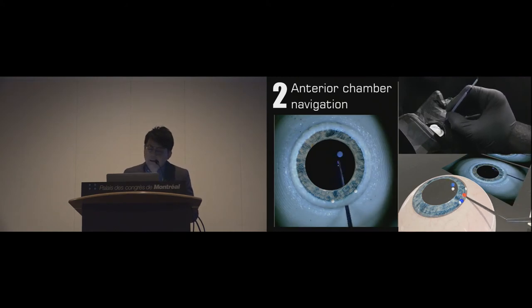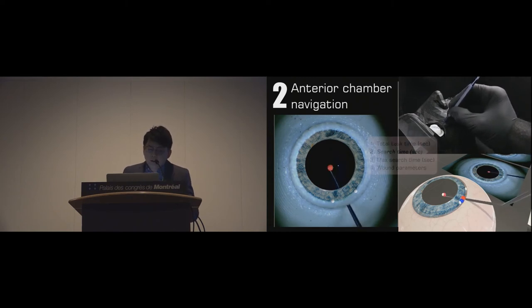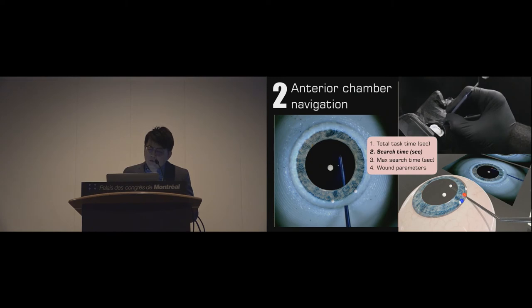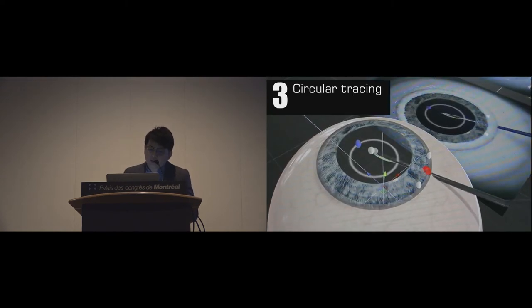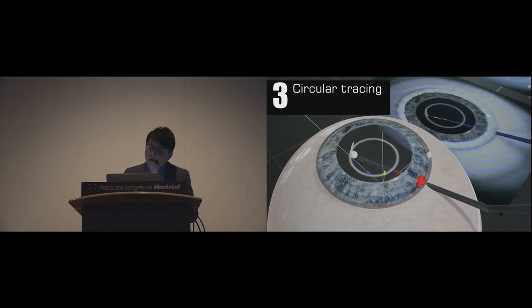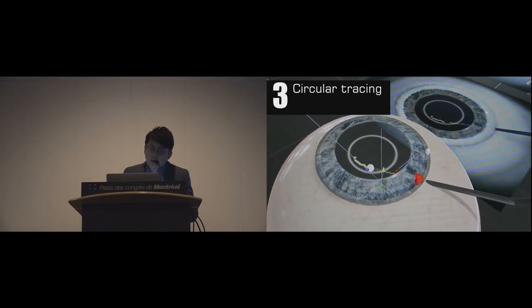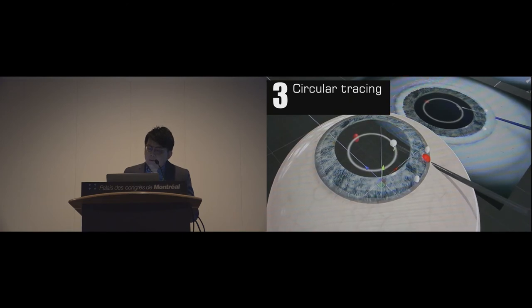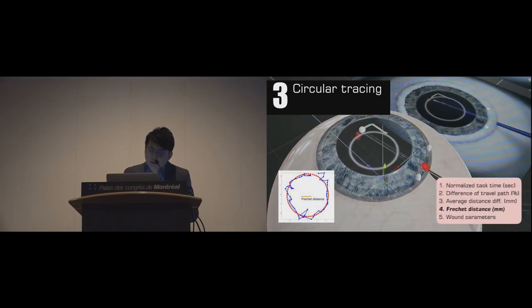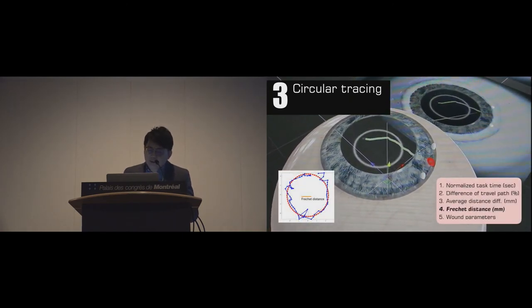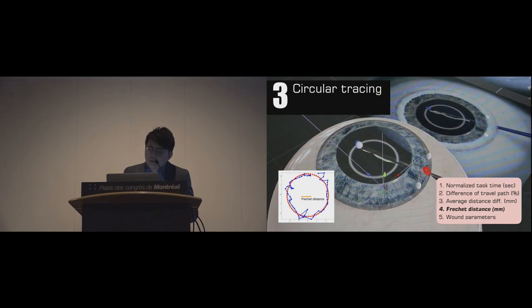The second is anterior chamber navigation module. The user has to touch the white ball first to pop up the blue ball at random depths. The time user takes from white ball to blue ball is the search time. The circular tracing module is the most advanced training of spatula. User has to trace the reference circle with the tip, and the Fréchet distance was calculated to represent the difference from two curves.